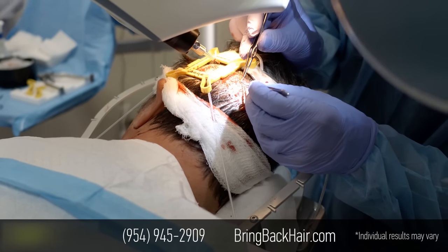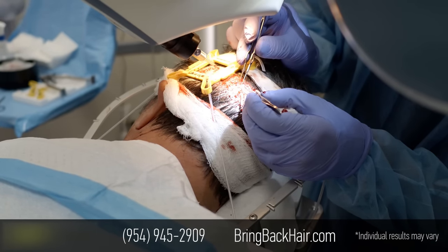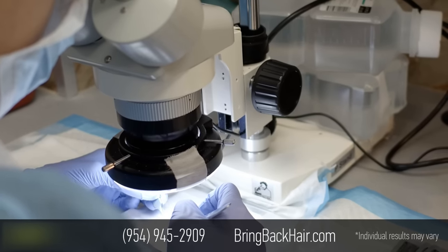As you can see here, this hair is trimmed, and on top of it there's a full-length hair. So once we're done, this hair will cover the harvesting area.